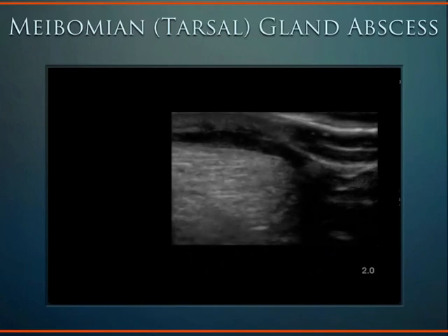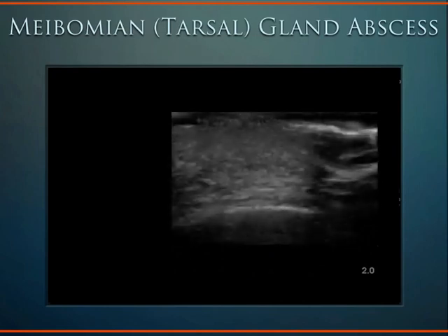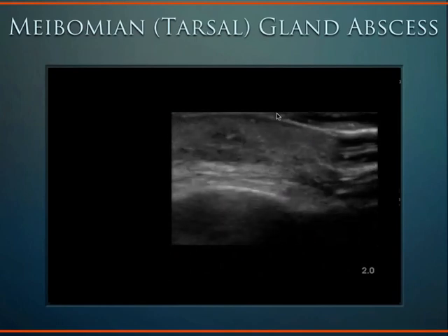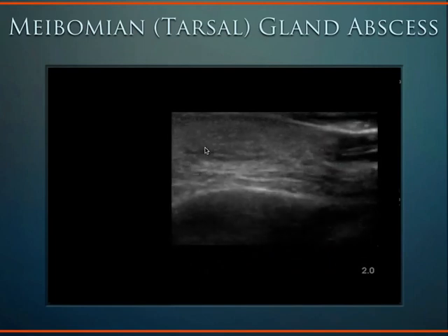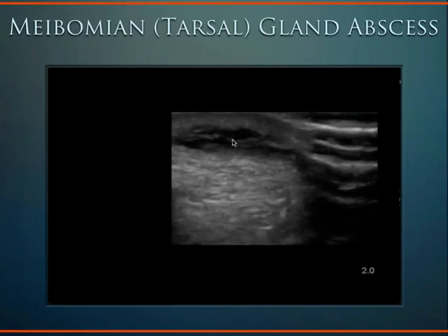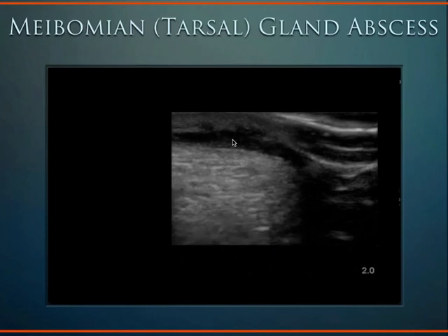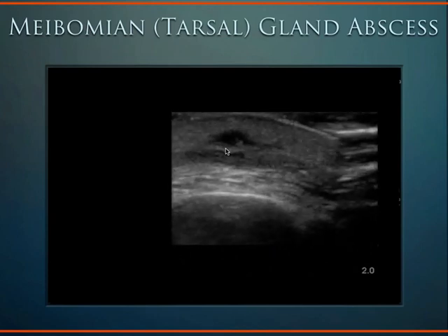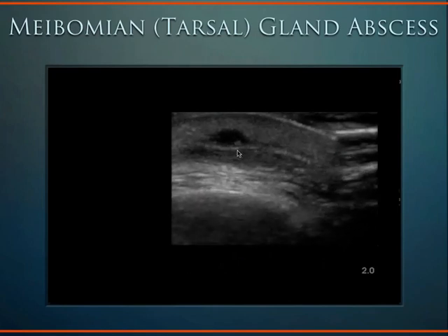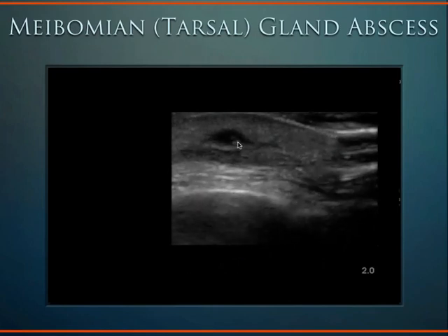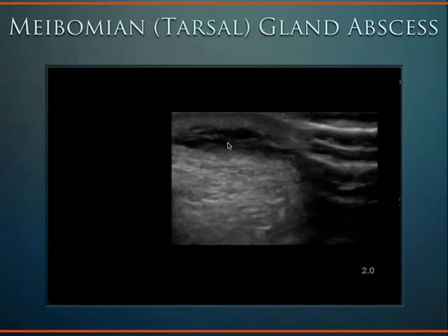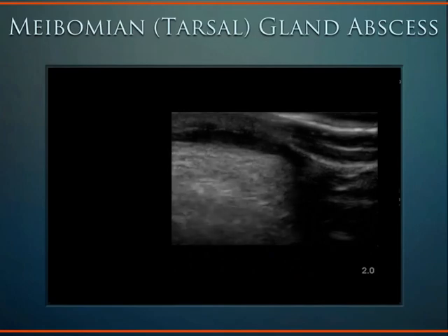This patient has a very small meibomian gland abscess. This is their eyelid coming along right here, and that's the meibomian gland right there. Normally you can't see that gland with ultrasound, but this patient had a very swollen eyelid and you can make out a small amount of abscess material — a little pus right in there. This abscess successfully underwent a quick lancing procedure to facilitate pus drainage.